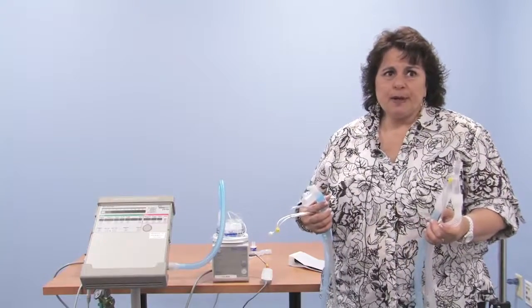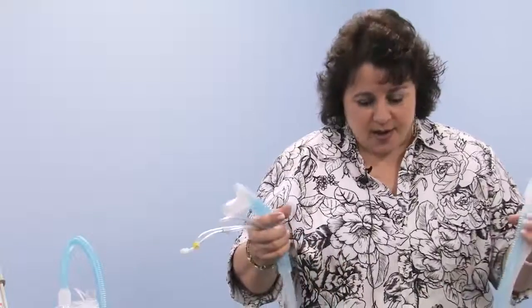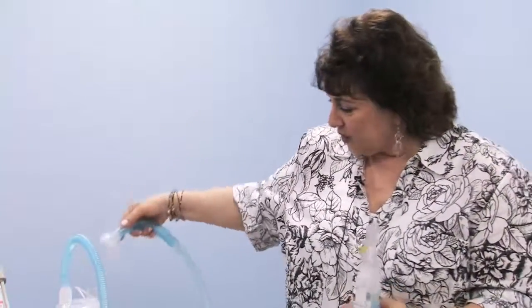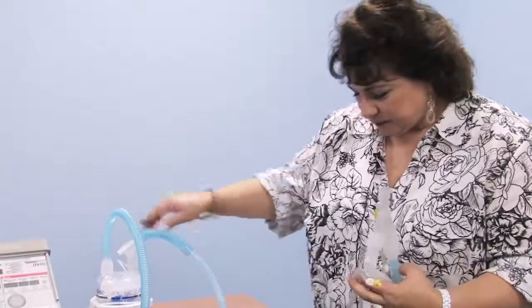If you were to put a heated water bag on your child's belly for a belly pain and it happened to come in contact with the probe, that would affect the humidifier. So many factors affect the humidifier, and please do check with your DME therapist if you're having difficulty controlling the water and the rain out in your hoses. So we are going to connect the main hose to the outlet of the humidifier.